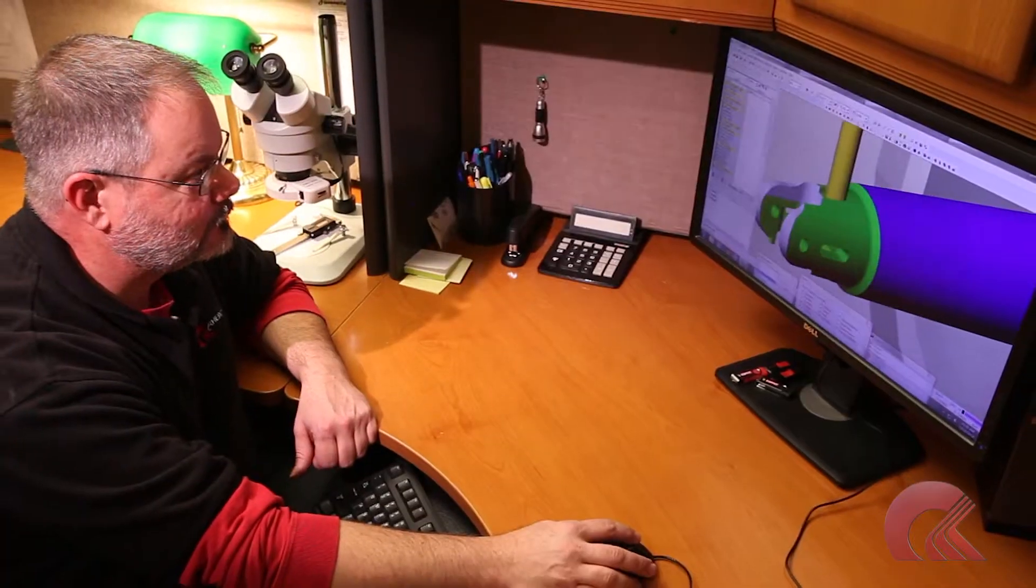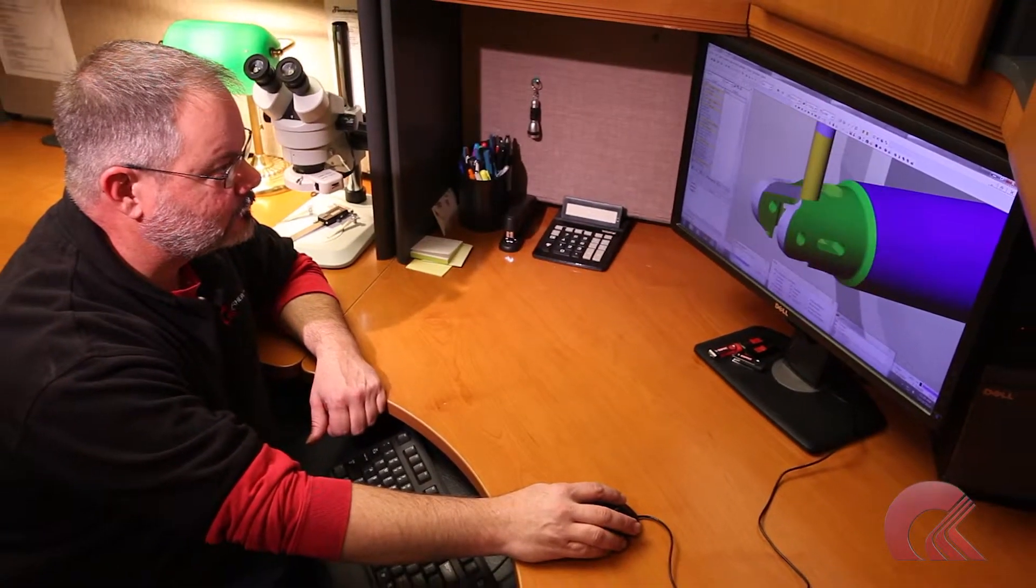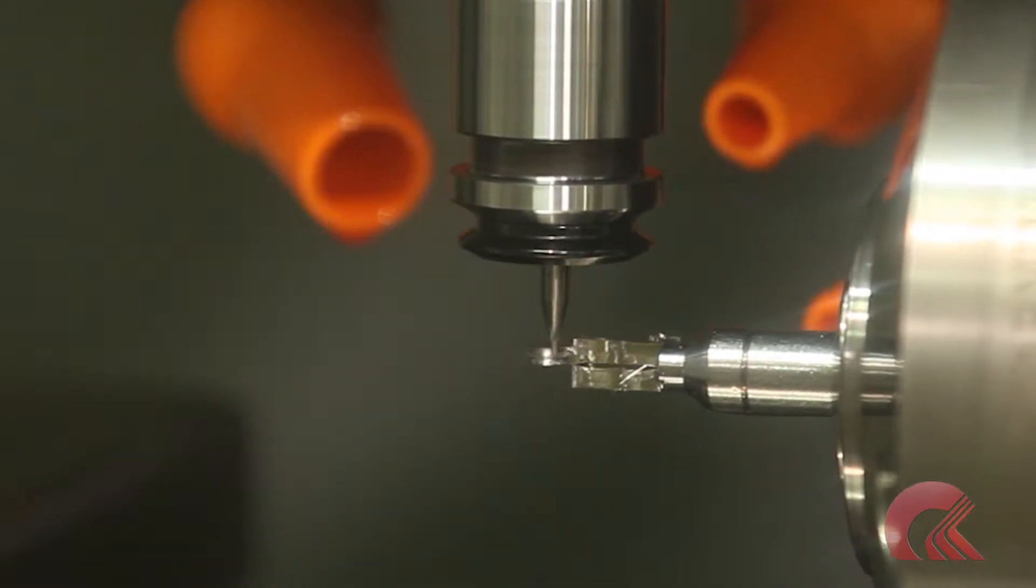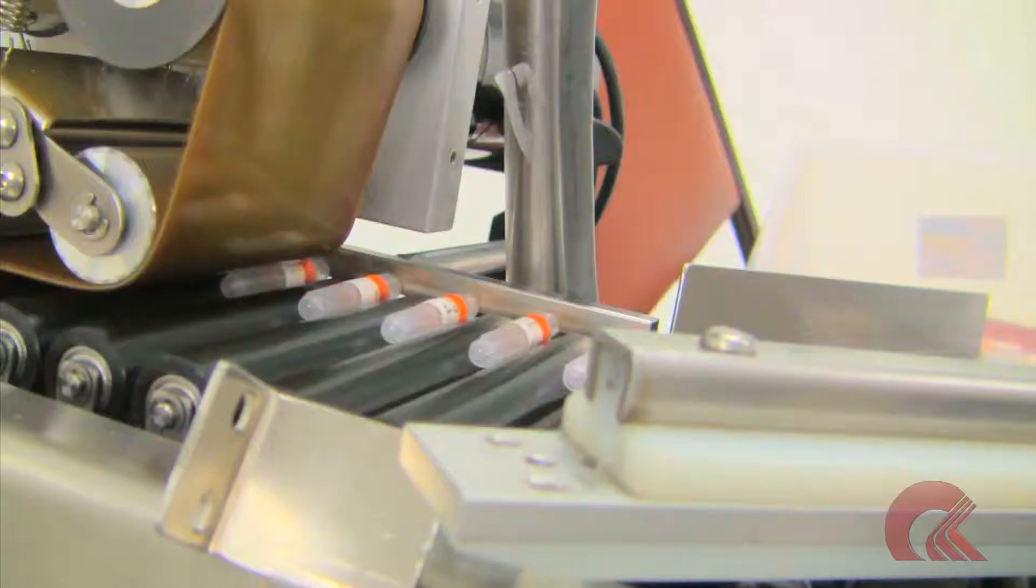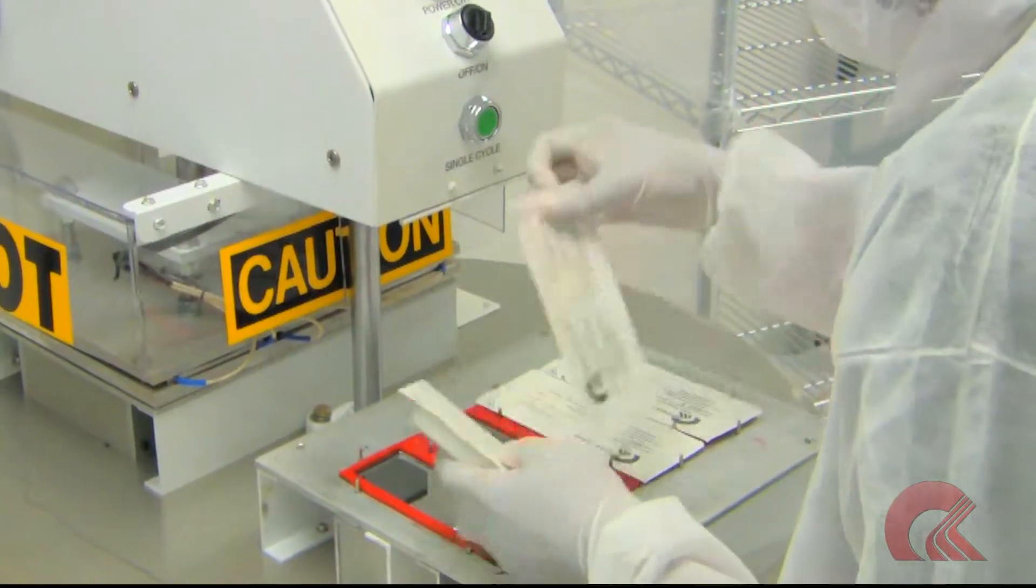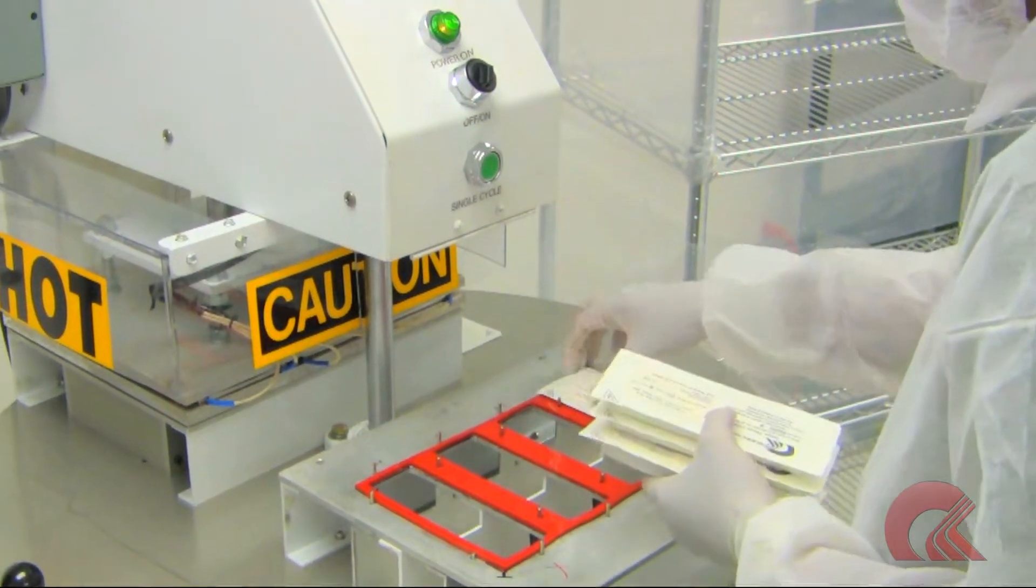The entire process at Rhine Precision, from design, to the selection of raw materials, to the finished product, packaged, sterilized, and ready to ship, is all included in the fulfillment of every order.